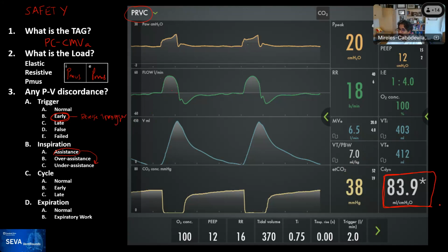Yeah, so it starts coming in. So now your brain, you see how the evolution of this has gone. In the past we were only looking at the tidal volume as our target, and you would say this is safe mechanical ventilation. The patient is getting a peak pressure of 20 on pressure control with a tidal volume of 7 cc's per kilo, which is still within what the ARDSNet guidelines, the trial, we would consider to be safe.